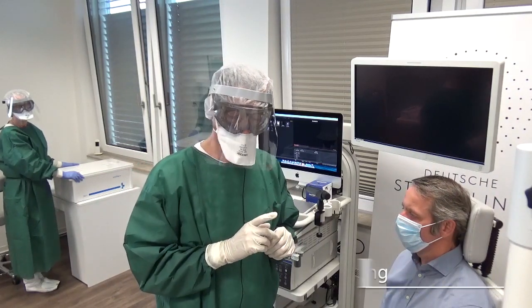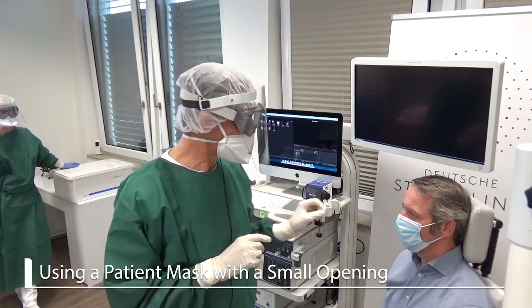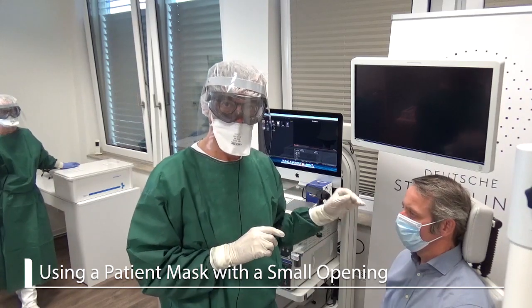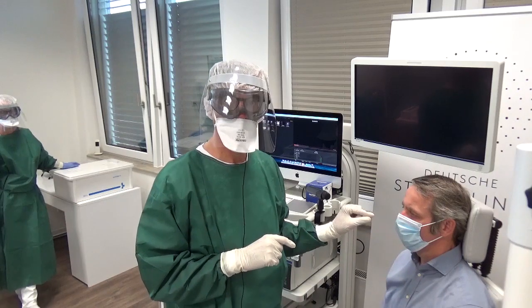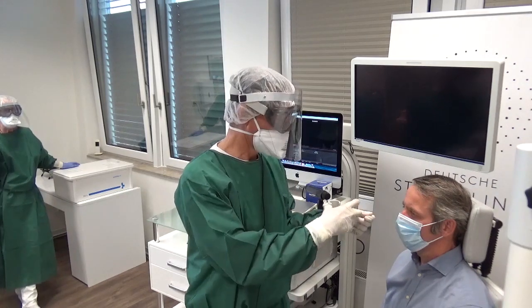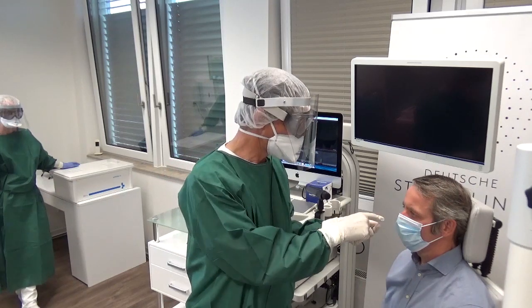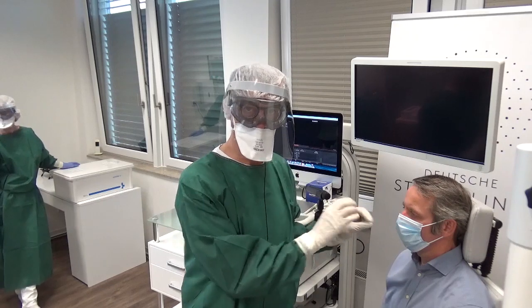What we can also do when we want to perform the endoscopy, if we don't want the patient to take down the mask, we can use the perforated mask that the patient already has on. We can then do the whole process of squirting the lidocaine into the nose through that little hole and doing the endoscopy also through this little hole.